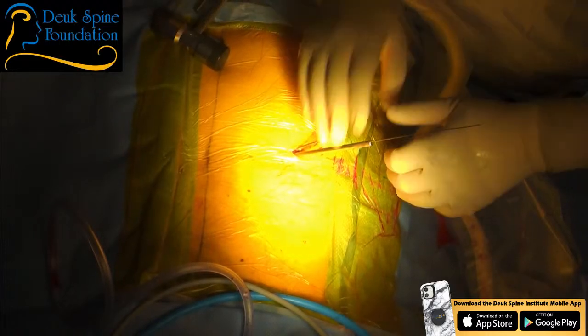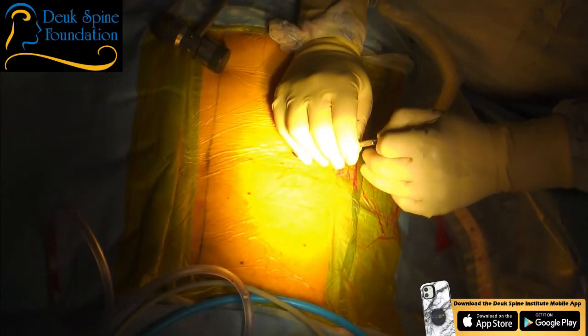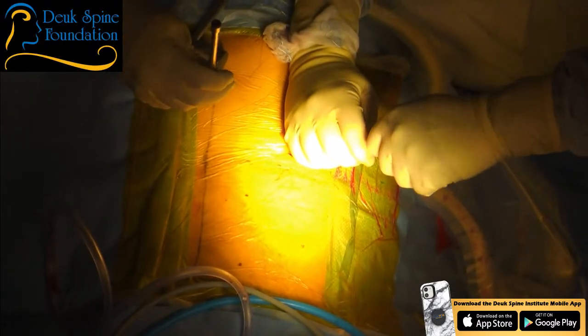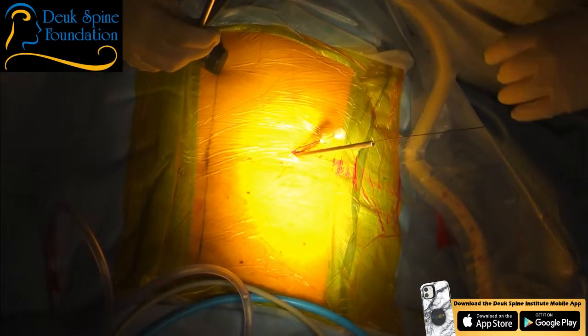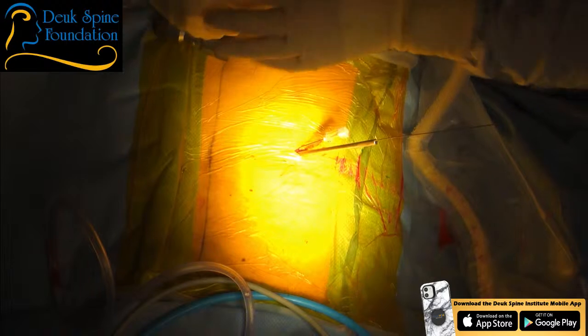I'm not ready yet. I just want to pull this guide wire back a little bit. Shot. So the guide wire is just getting pinched a little bit.